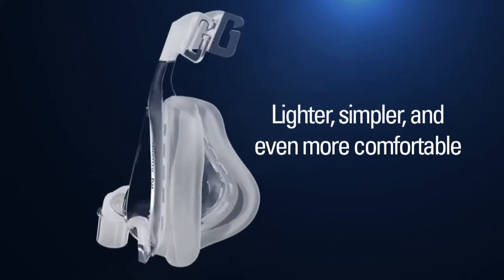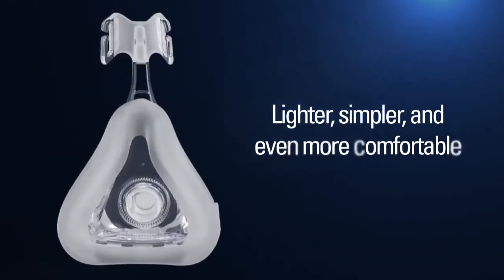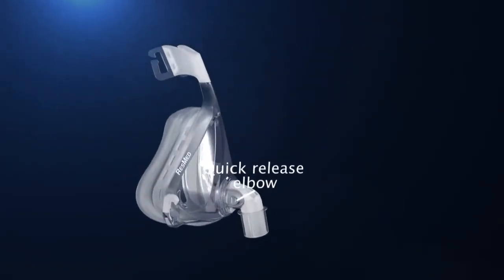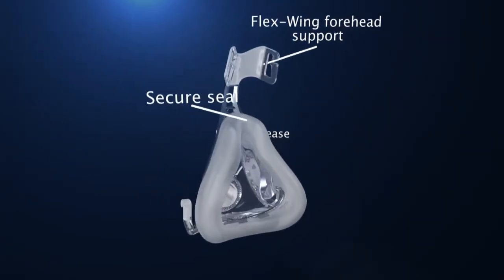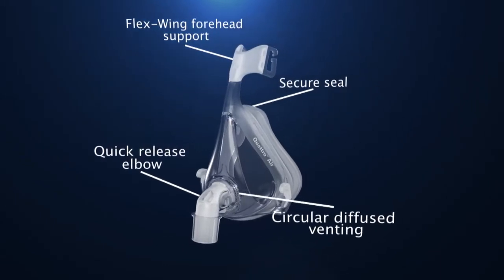It's lighter, sleeker, simpler to use, and even more comfortable than the Mirage Quattro, while retaining all the performance attributes that have made Mirage Quattro a winner in the market. Quattro Air is loaded with features that work on simplifying the user experience to encourage easy patient acceptance. It's ideal for the newly diagnosed as well as for existing full face mask patients looking for a lightweight, comfortable, and simple to use alternative.